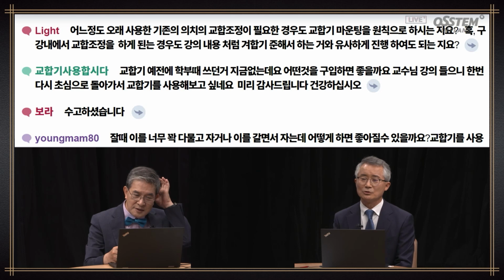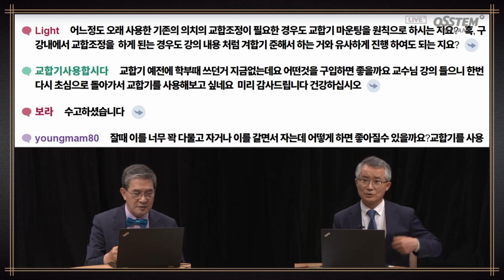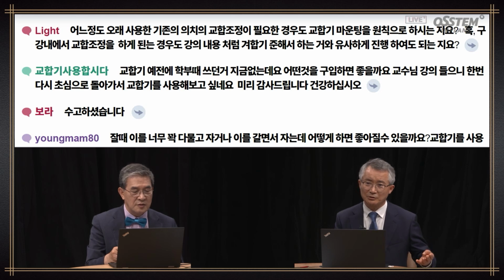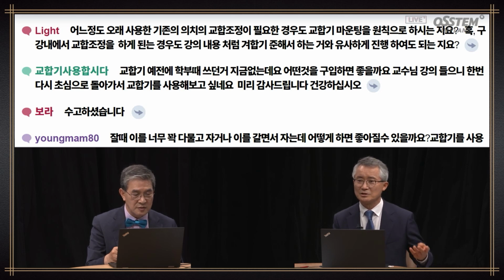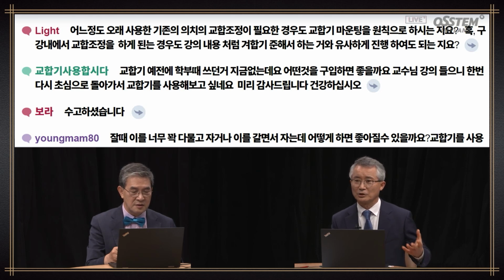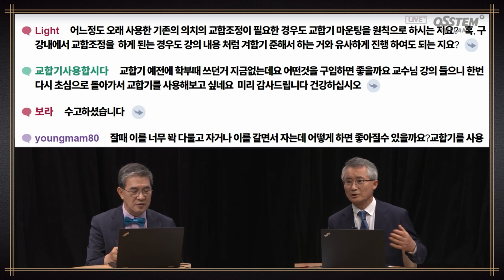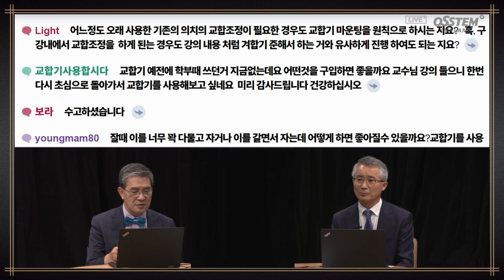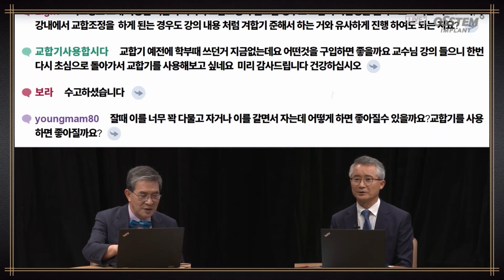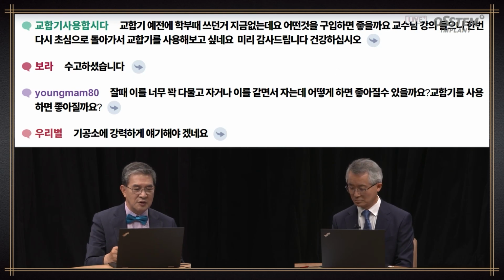When we look at an existing denture, we need to check whether relining is necessary. You need to check the impression surface. If relining is necessary, you need to do that first. If everything is perfect, then you move on to occlusal adjustment. You need to mount it on the articulator. That is not an option. This is a must. Understood? Let's use articulators.